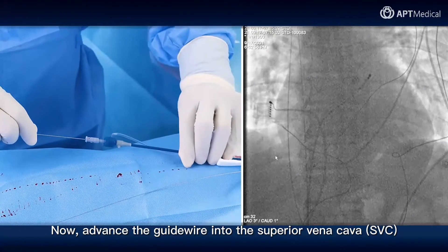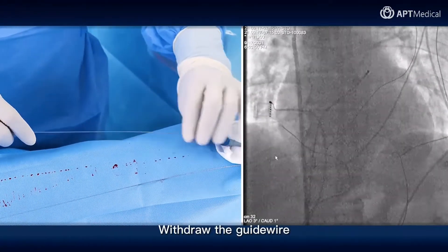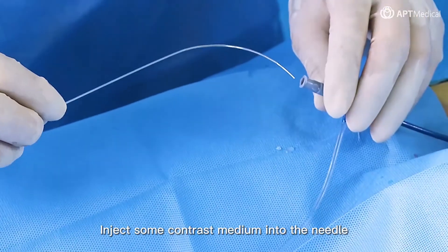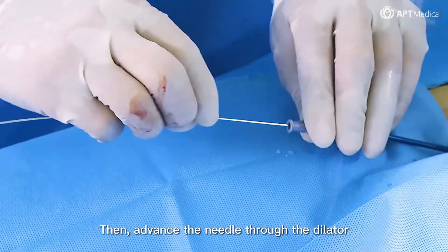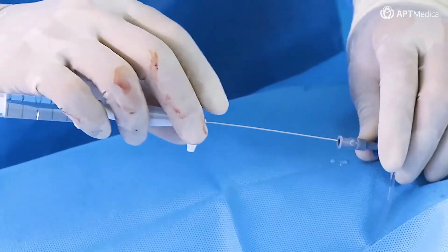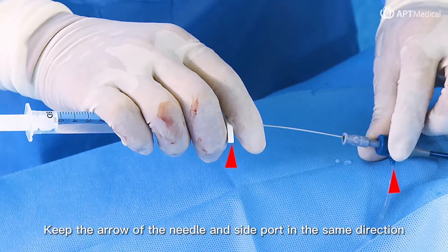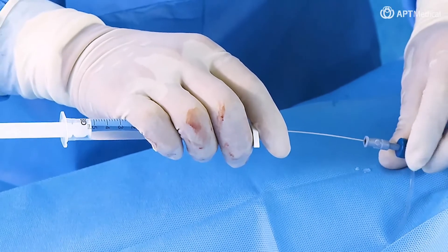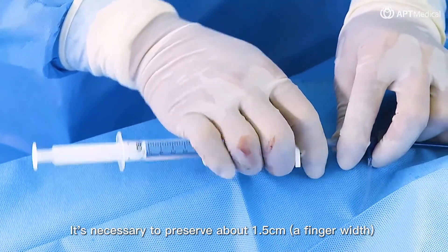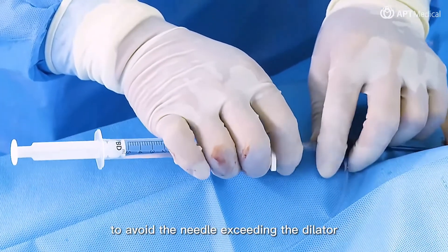Now advance the guide wire into the superior vena cava, then advance the sheath into the SVC. Withdraw the guide wire. Inject some contrast medium into the needle, then advance the needle through the dilator. Please note: keep the arrow of the needle and side port in the same direction. It's necessary to preserve about 1.5 cm — approximately a finger width — between the handle of the needle and the sheath, to avoid the needle exceeding the dilator.